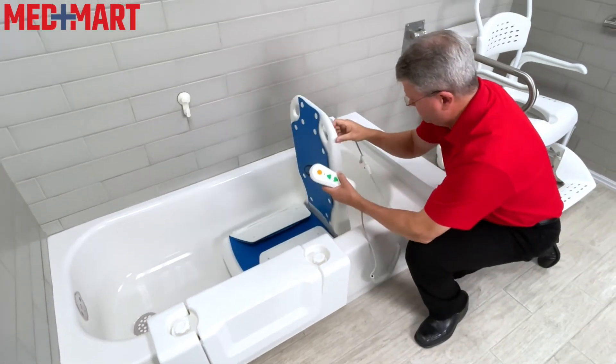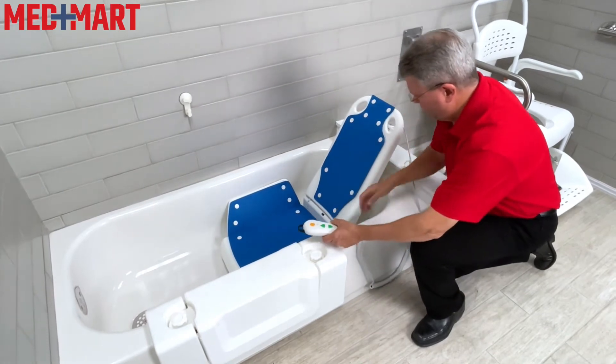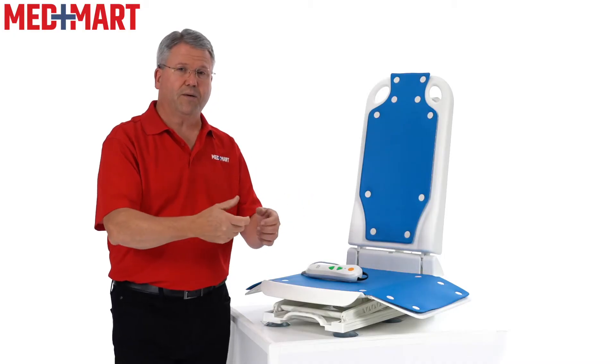Installation is easy — it basically just drops into the tub, unfolds, and uses suction cups at the bottom to position it. Always make sure that if you are moving this or taking it out for storage, you are releasing the suction cups properly.